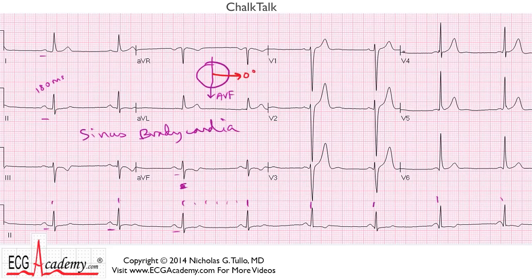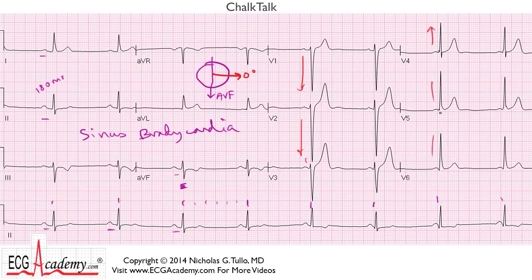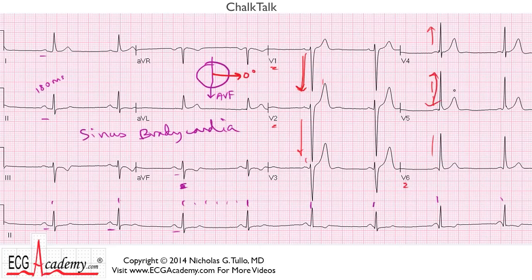If we look at the precordial leads, examining the QRS complex, we see very large S waves in V1 and V2. And the R waves progress fairly normally — there's a tall R in V4, so the transition point is V4. But again, you've got large voltage here. So what's the voltage criteria for LVH? Well, if we add up V1 plus V5 or V2 plus V6, and if it adds up to more than seven boxes, then voltage criteria for LVH is present. I see four boxes here and another four boxes here — that makes eight — and so we can say that LVH is present.